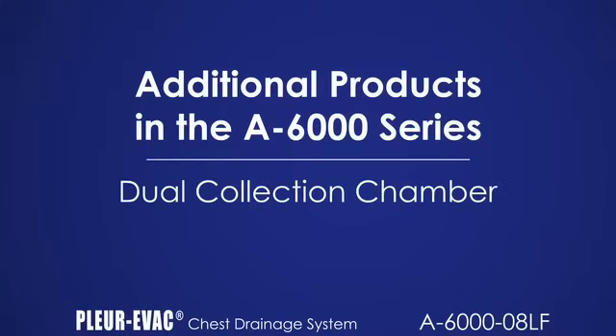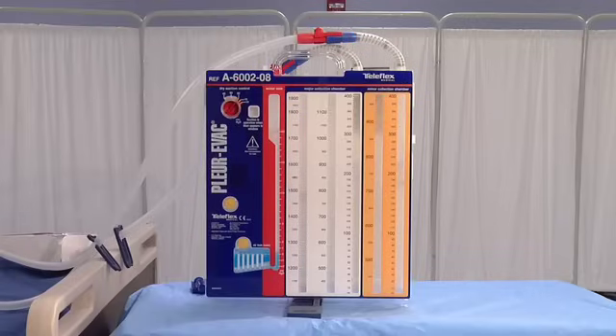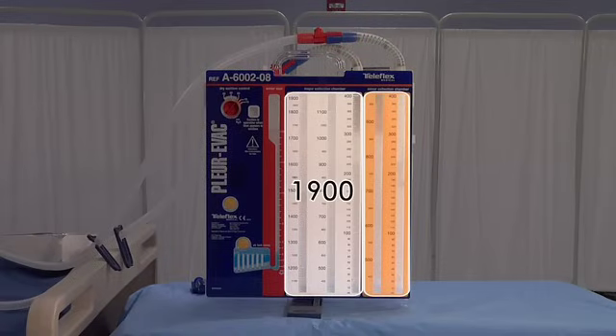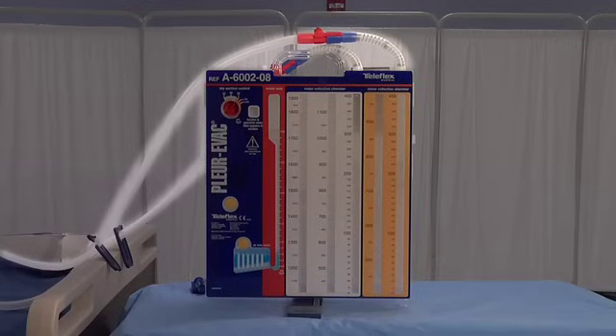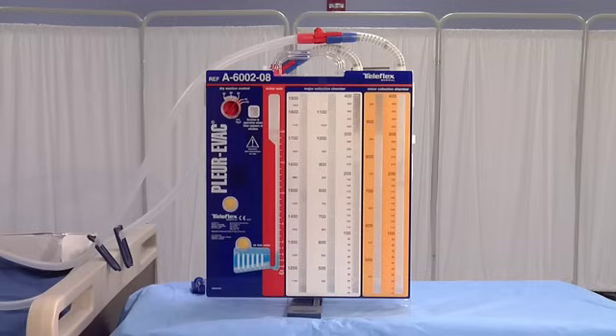The A6002-08LF is a dual collection chamber product that sets up and operates exactly the same as the single-chamber A6000-08LF, except that it has two large collection chambers — 1900 cc and 950 cc — two patient tubes with inline connectors, and needleless sampling ports. With this model, the collection from each separate thoracic catheter can be measured. This is only to be used with a minimum of two thoracic catheters, with each patient tube attached to a catheter.